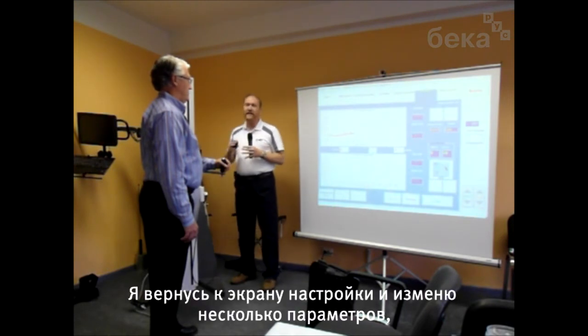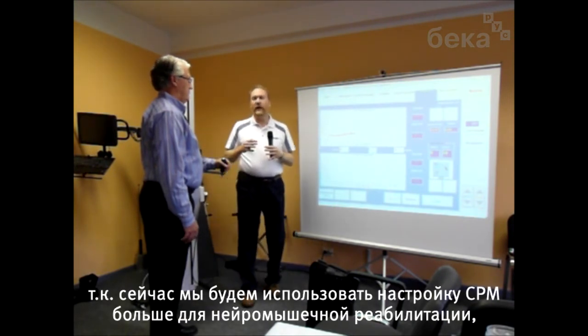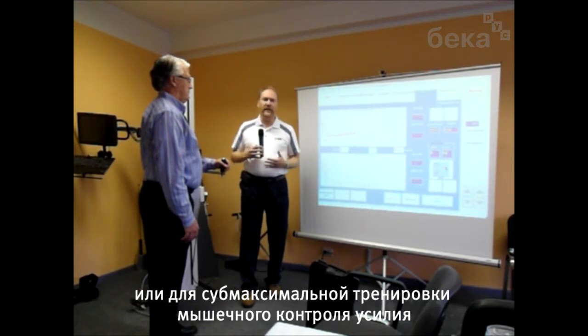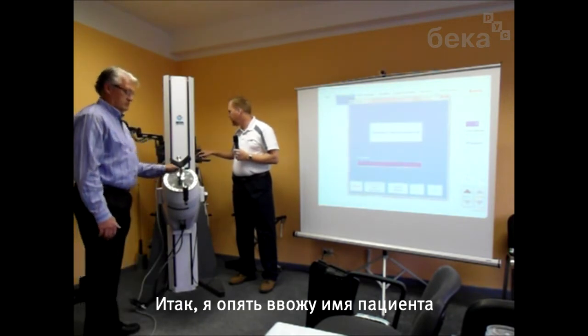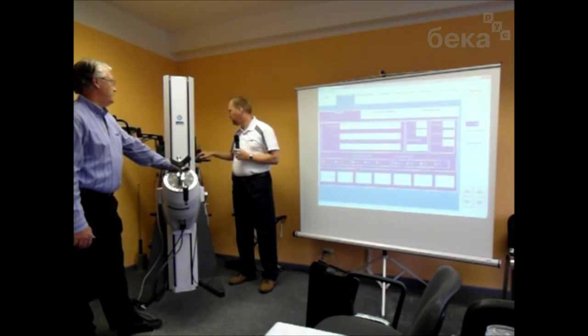I'm going to go back into the setup screen and change a couple of the parameters, because the next way we're going to be using the CPM mode is more for neuromuscular re-education or a submax motor control training activity. So I'm going to bring up the patient name again. We'll switch to right this time.